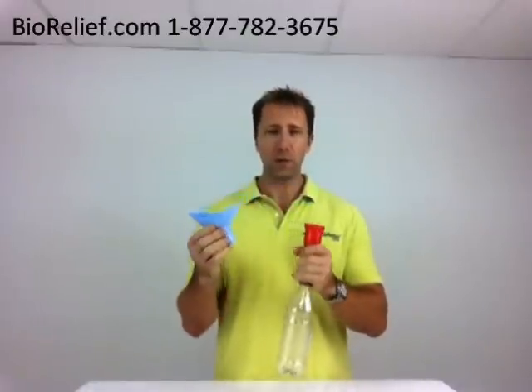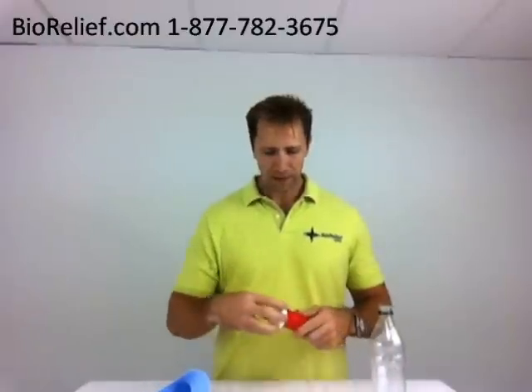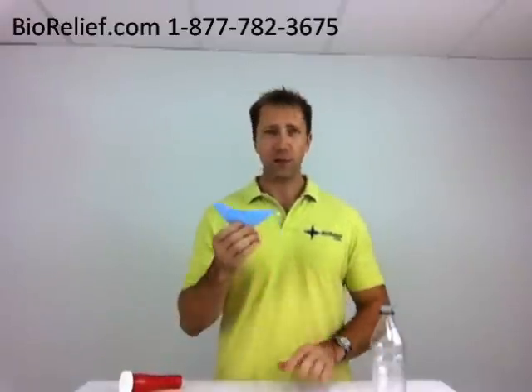The Lady J is also used with the Little John that you might have seen in a video we did as well. You can find both these items at Biorelief.com. Again, this is the G-Funnel that allows you to turn any Coke bottle — 2 liter or 20 ounce — into a urinal, used with the Lady J for females. You can find it at Biorelief.com. Thank you.